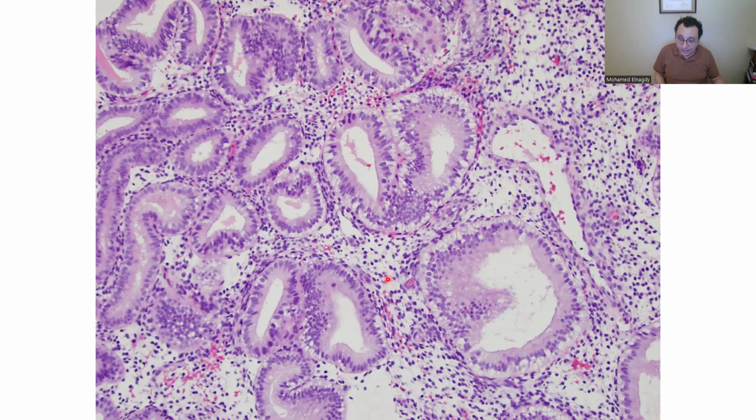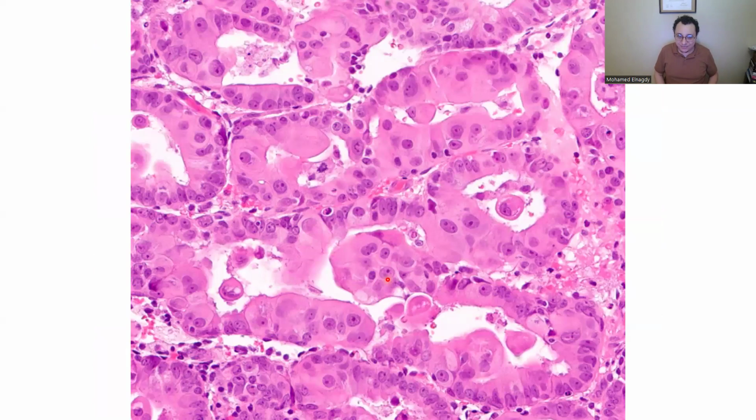Then Heba. Heba, what do you think about this one? That's a tricky one. Maybe late secretory. Anybody has a different opinion? Are these fragmented glands? Another push: are these Arias-Stella? I don't know. But Arias-Stella must look irregular. They are not irregular. They still look like glands.